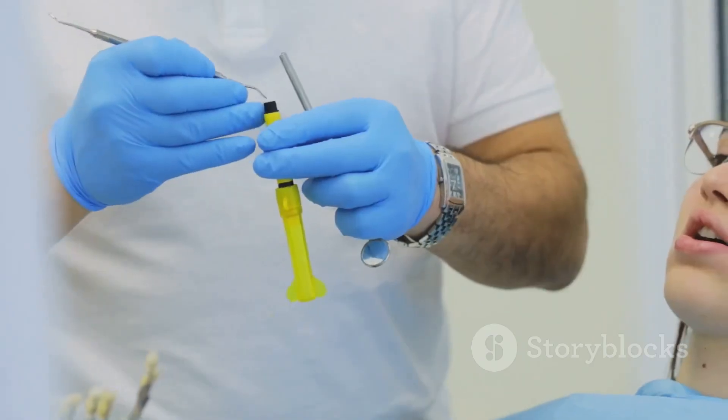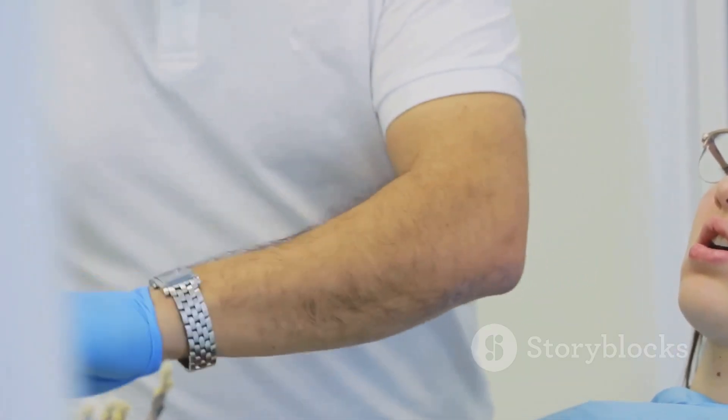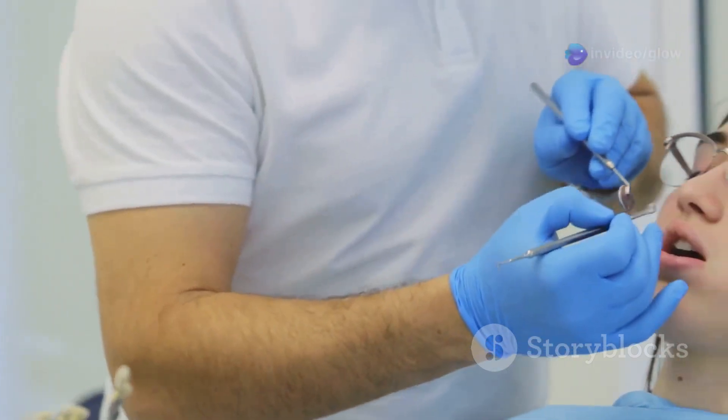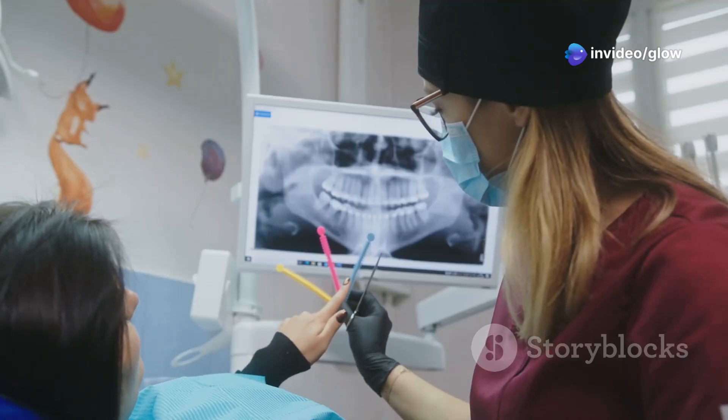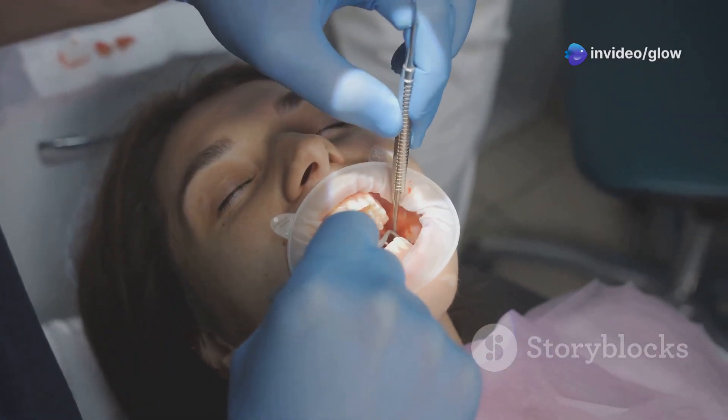Step two: resistance form. This is where you make the cavity strong enough to resist fractures. Flatten the floor, remove any weak structures, and keep the walls perpendicular to the forces of chewing. And don't skimp on the depth — it matters.